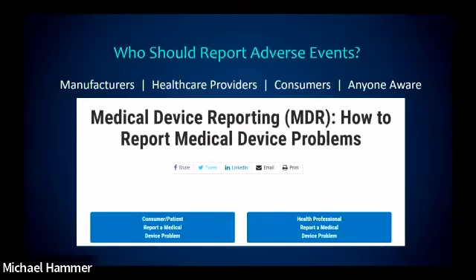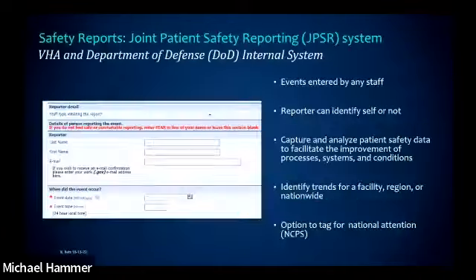And what's cool about it is whether it's a healthcare provider or a consumer providing that report, the manufacturer then receives the copy of that report and has a responsibility to reply, because the FDA is regulating their device in this realm. So it's nice, and I'll show you the examples of what you get from a report and then a response from the manufacturer. Really easy to download, also available in Spanish in the US, and I'm sure, different languages as appropriate if needed.